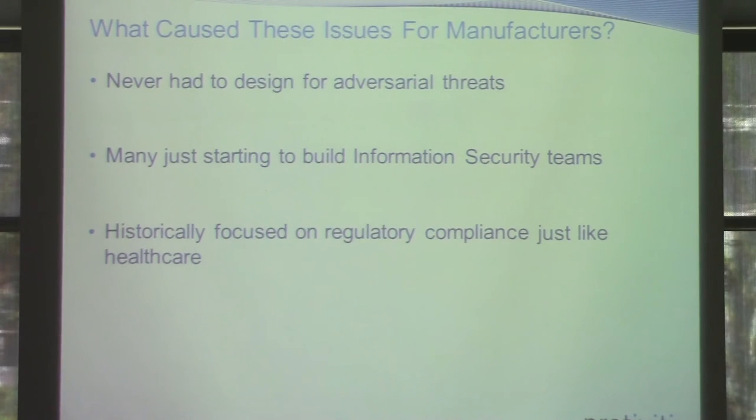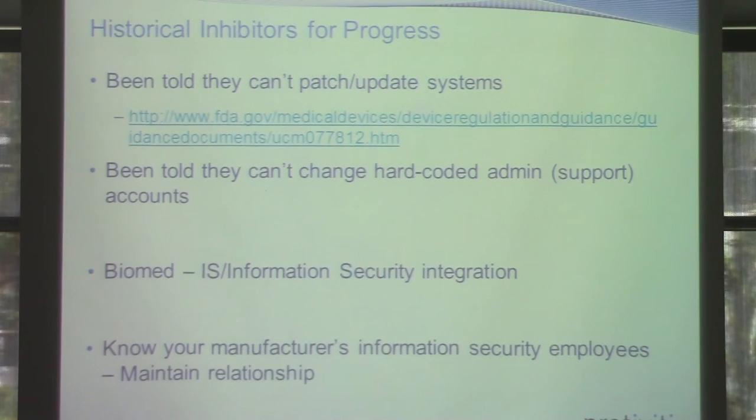So if you hit the override code and you hit enter, then it would shoot out max radiation, and the patient would just start getting shot. That was back in '85 and '87, so they've done good things on software, but they just haven't focused on security.